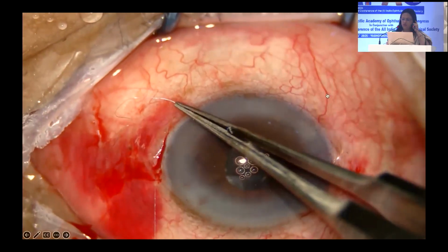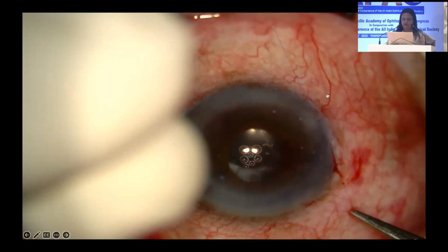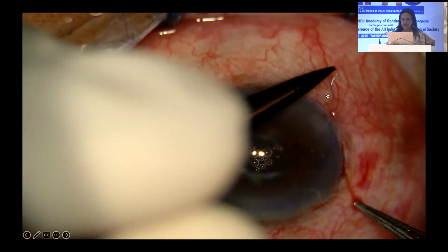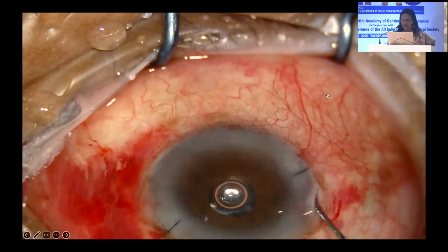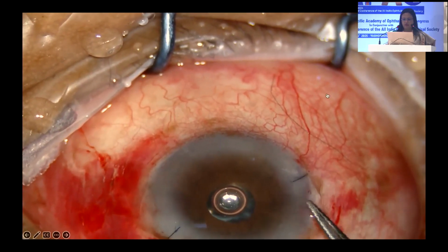Whenever you do this, even if there is no vitreous presentation, it's always better to check for vitreous presentation in these cases, and you can put some triamcinolone and check for the vitreous presentation and then complete the case. In this case, I was planning for a glued IOL but converted into this, so I used the glue to seal the pockets, but that's absolutely not required.